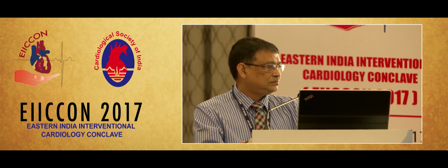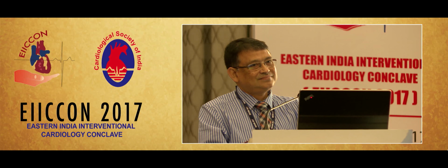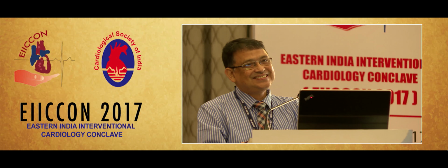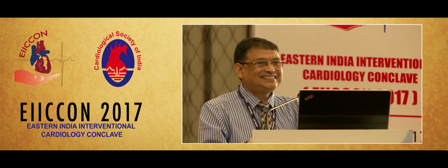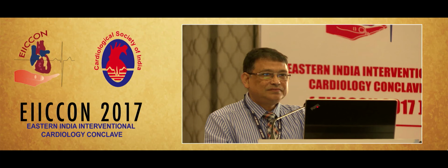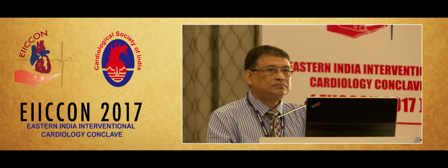So, Ramesh, have you any short comments to make, because you are a pioneer in this field? I agree. Never jail the wire for culotte or for any sort of DK crush, any technique, double vessel stenting. Never jail the wire between two stents. I have forgotten and left it as well at times. If it's a mistake, it's a mistake. You cannot repeat it. Unfortunately, you cannot plan to leave the wire. Don't leave the wire. The jailed wire sometimes can break. I always use non-hydrophilic wires in the side branch.